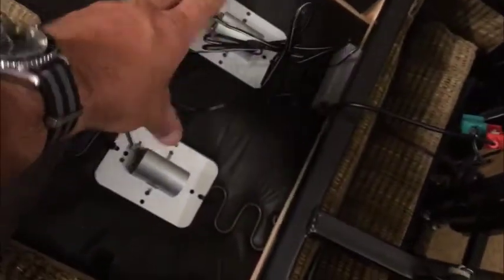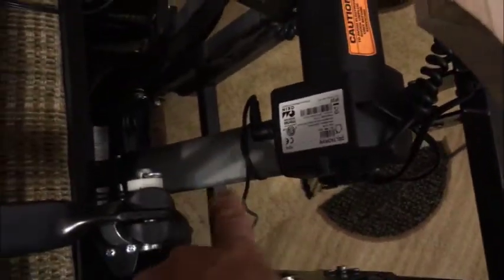If you open the bottom of the chair up, this is just Velcro. Here you have the motors for the massaging. The one motor there is in charge of lifting the base up where you're standing, and the second motor here controls the backrest, which allows you to have that full reclining into that sleeping position. So again, for those of you who need a sleeping position chair, that's where it's at.